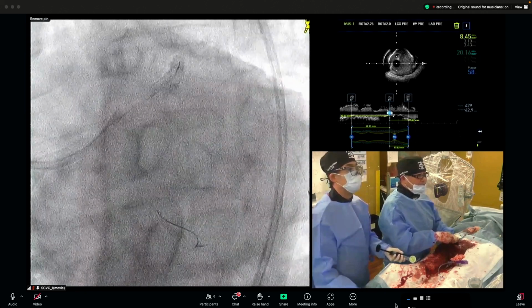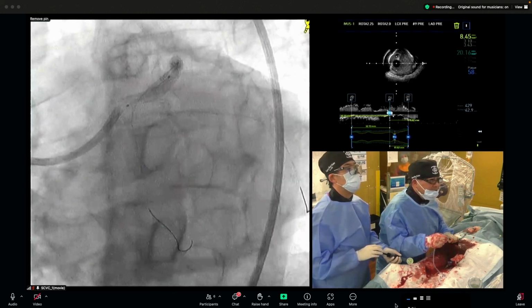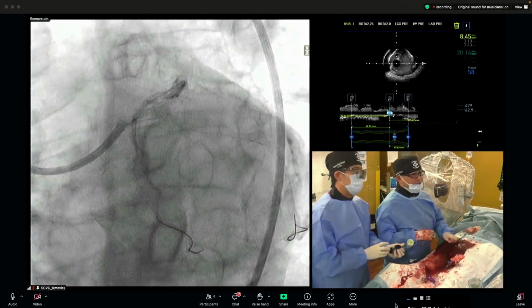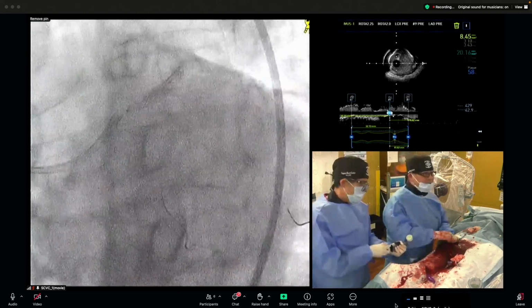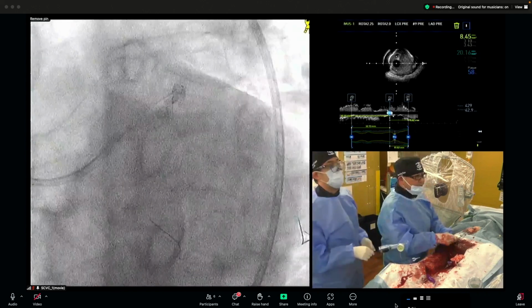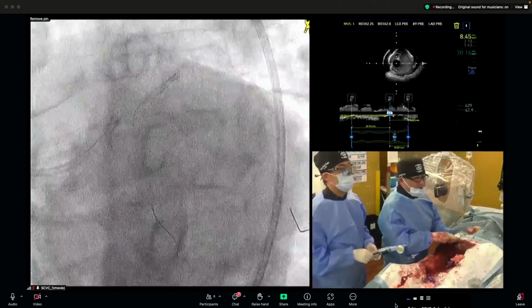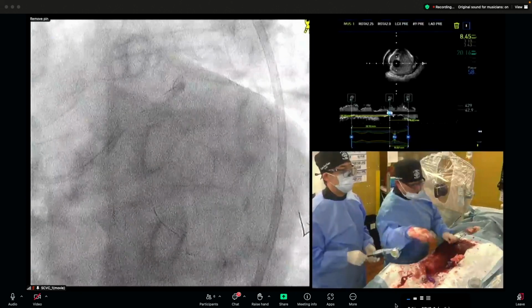Tachima-sensei here. We noticed that you usually go beyond the rated pressures on your stent deployment. Is that usual for you? Sorry, one more please. 24. Okay, deflation. They are asking whether it is always the case that you expand beyond the rated pressure.